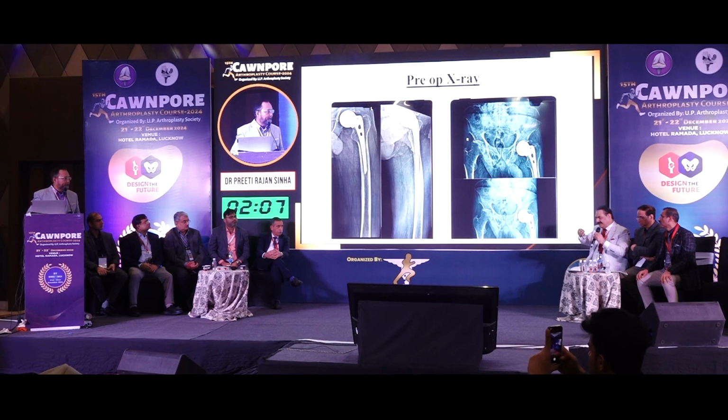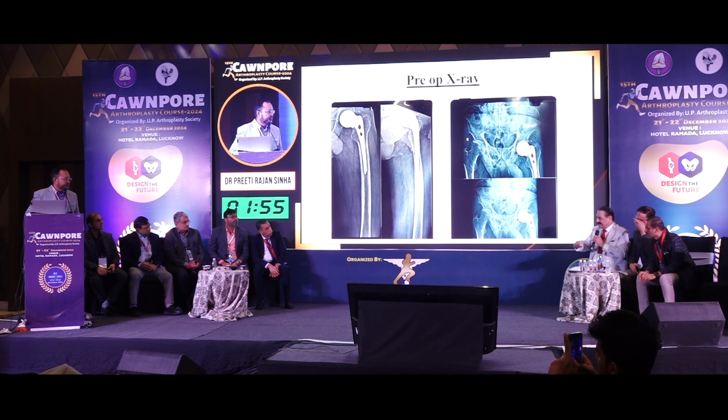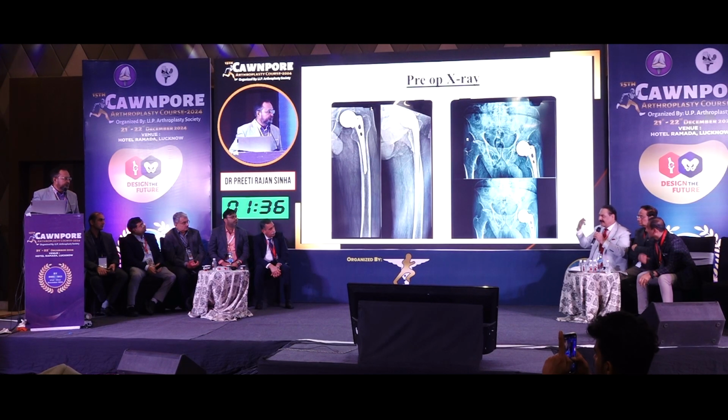We saw one case where cemented implants were removed and cemented implants were put. That is not desirable, in the sense that here there is no cement all around. Once you put cement, it integrates into the cancellous bone, and once you remove that cement, the cancellous bone is gone and you get cortical bone. So putting cement on cortical bone is not desirable. Similarly on the acetabular side, once you remove a lot of cement, not much bone is left, which is honeycombed. So it's better to put an uncemented one. But if money is a problem, then one can come. Yes, sir.